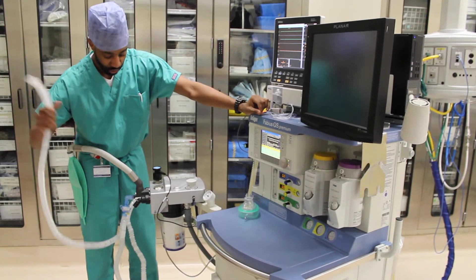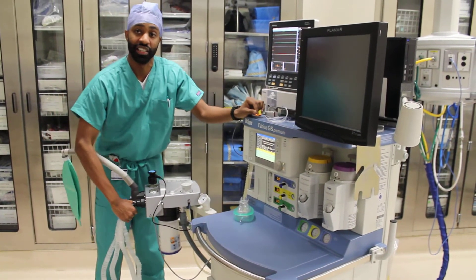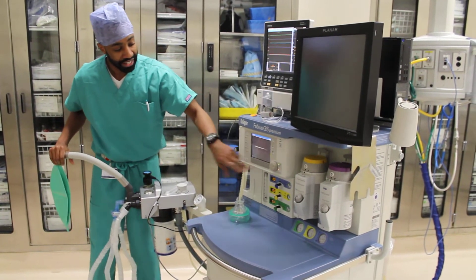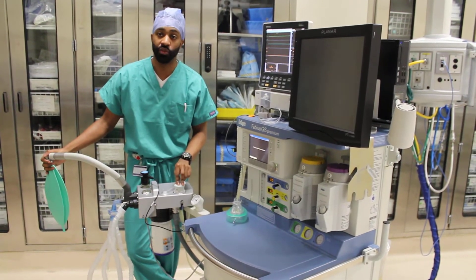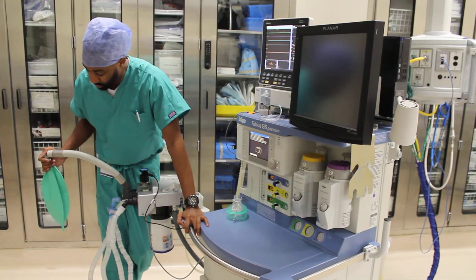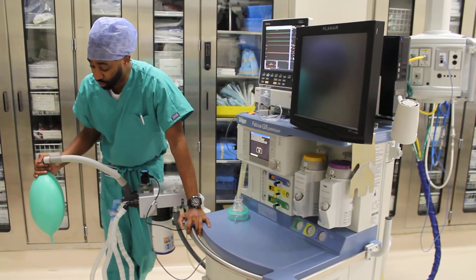Once that flow sensor has been calibrated you reattach, and now we're ready to check our leak and compliance test. In order to do that we turn our APL valve between 40 and 50 centimeters of water, and then we use our O2 flush button to inflate this between 15 and 30 centimeters of water.